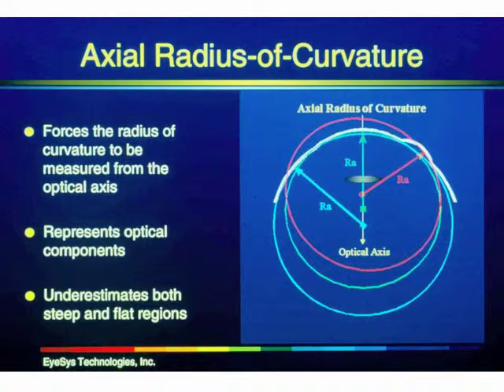It's not really dioptric power. Dioptric power is a derived measurement. What we're really measuring is the radius of curvature at different parts of the cornea. And it sounds like that is only one measurement, but it turns out that it's not, and I'm going to show you why that is.